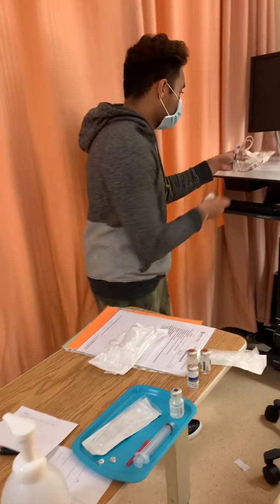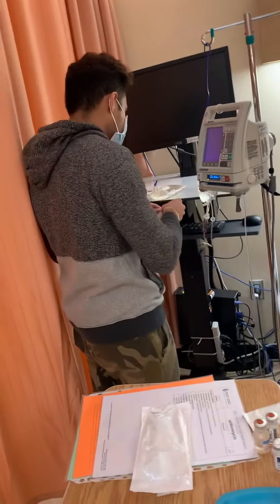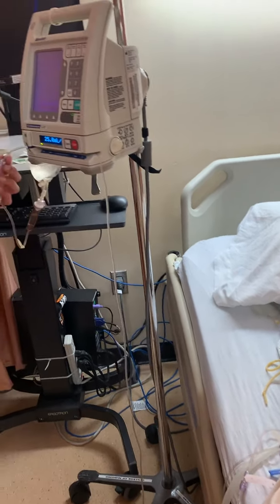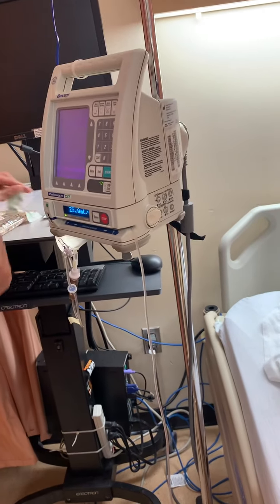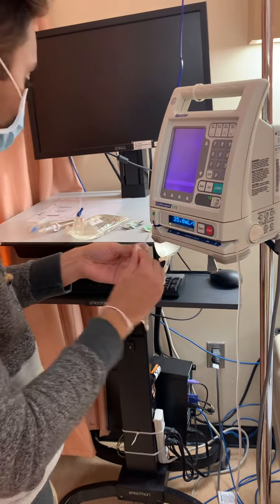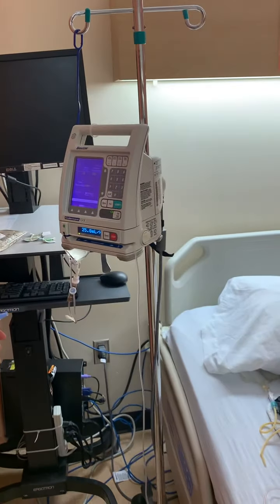Okay. So we're just swabbing this port for 30 seconds. So we're going to hang it into this port above the pump for the medication. So we're grabbing a new alcohol swab. So we're swabbing for 30 seconds, letting it dry for 15. So we swab for 30 seconds, let dry for 15. So good, so we know it's still sterile. Making sure it's clamped. So clamped, it's all good.